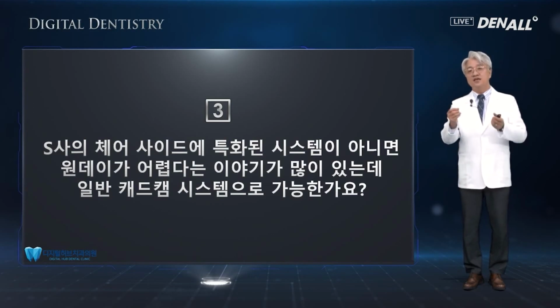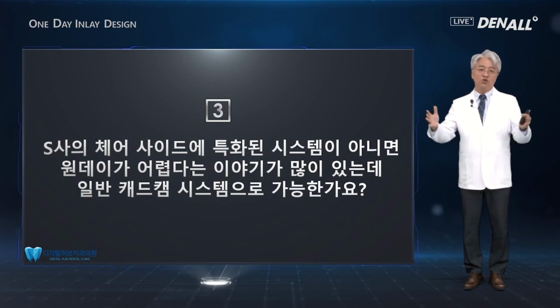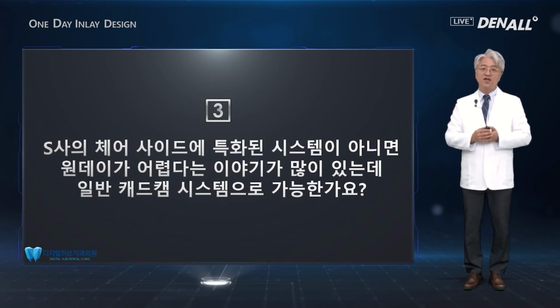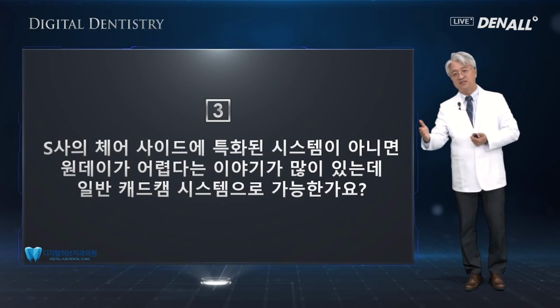This is because milling and design time is very short with this system, so one day was possible. But the disadvantage of those chair-side systems, I think, was that the scalability or expansion to clinical cases was limited, so you cannot do everything, which made it really challenging.